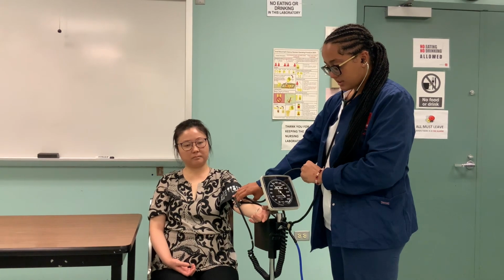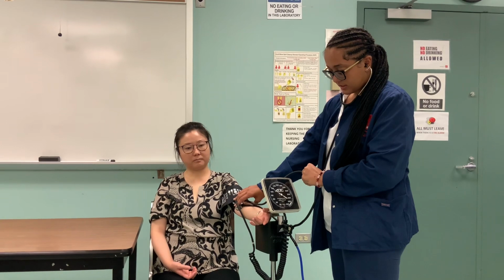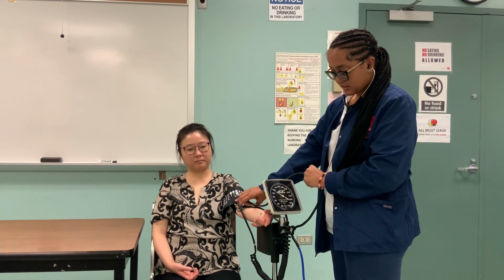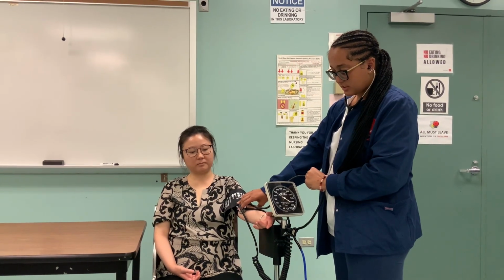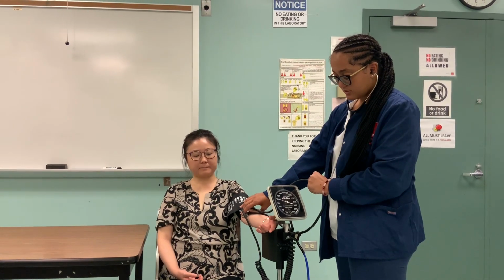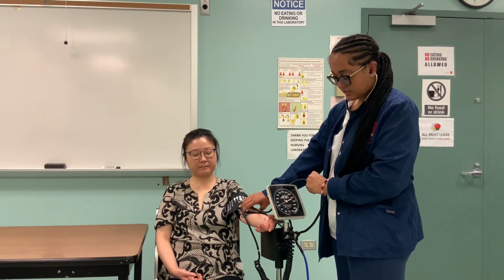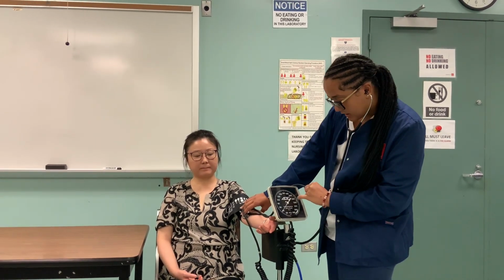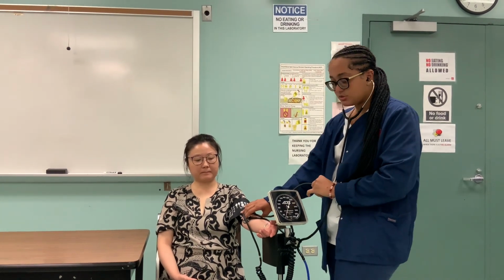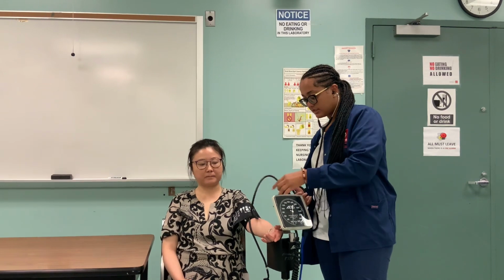So I heard it around 165, and now I'm listening for the diastolic, which is gonna be the last sound. And then the last sound I heard was around 82, so that would be the diastolic.